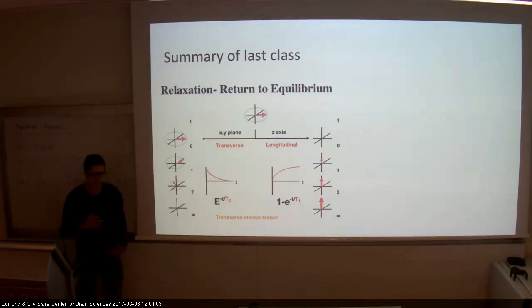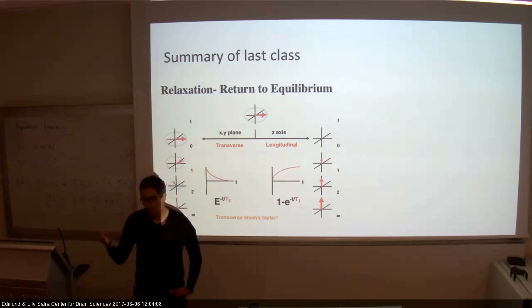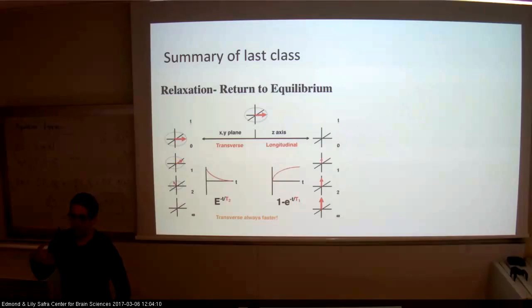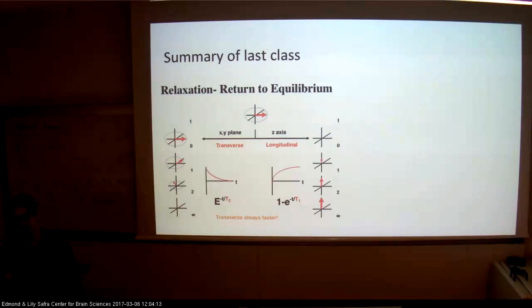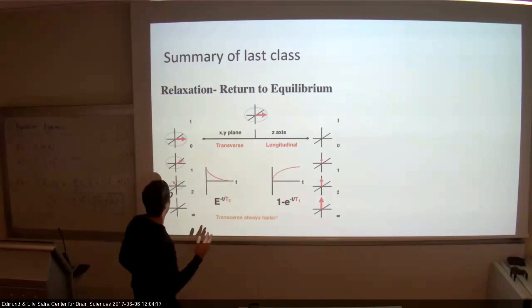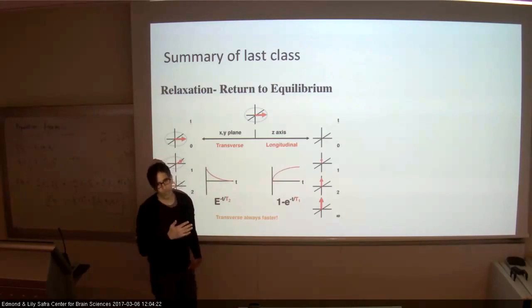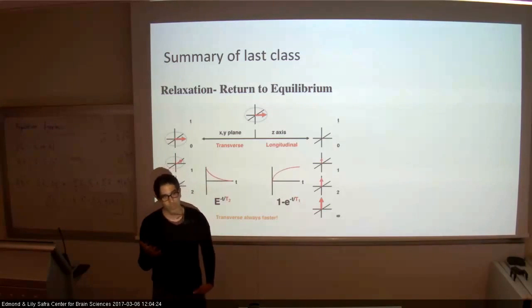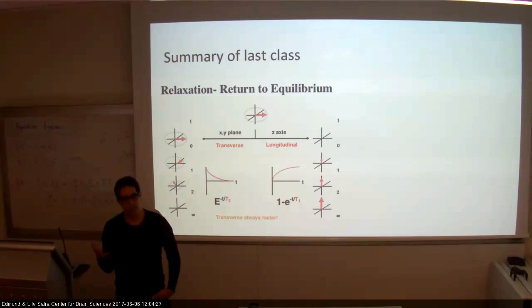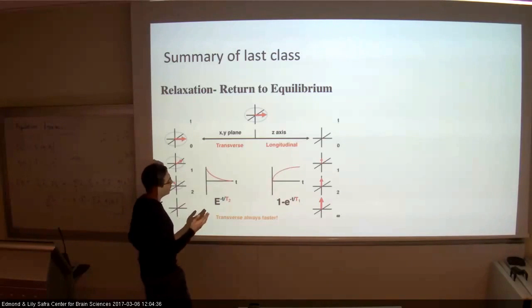And then we identified relaxation mechanisms. There is excitation, and so we get the system out of its steady state, and then we measure that. But while we are measuring, the signal is gone. We're losing signal, right? And this loss of signal was created by several phenomena, which we call relaxation, and we defined at least two types of relaxation.